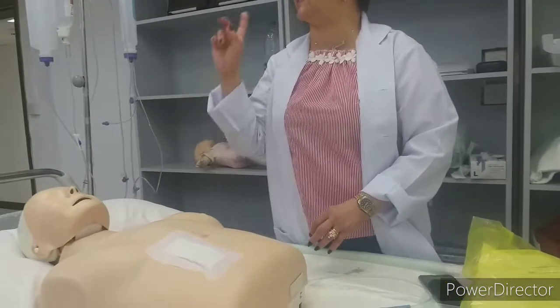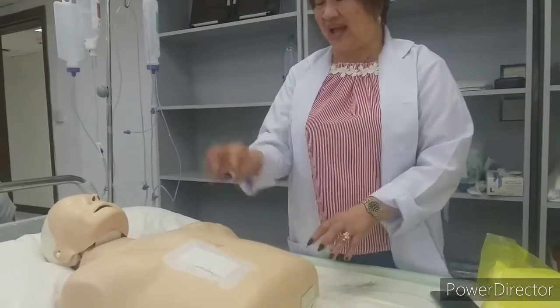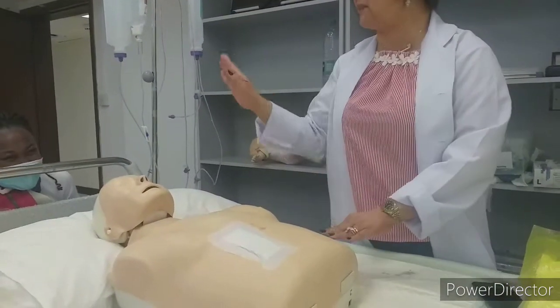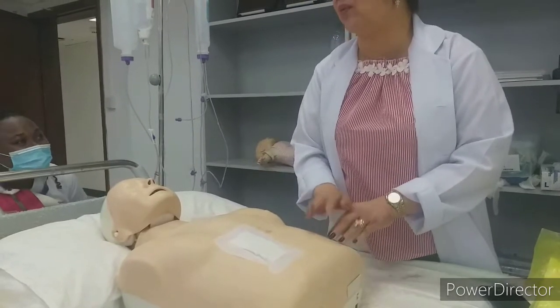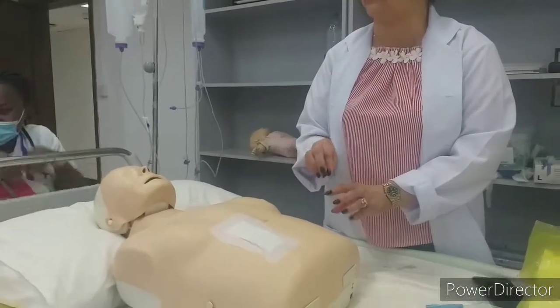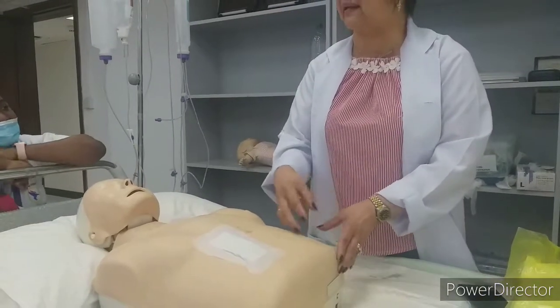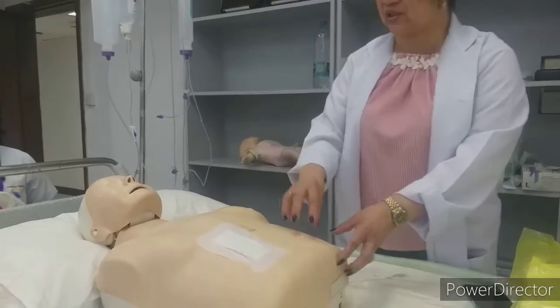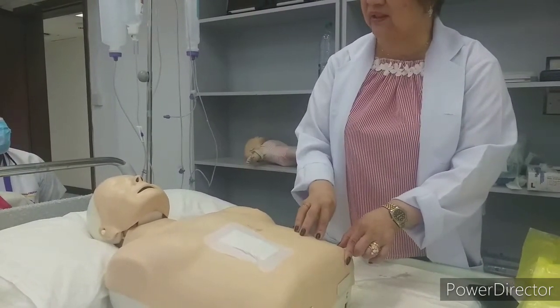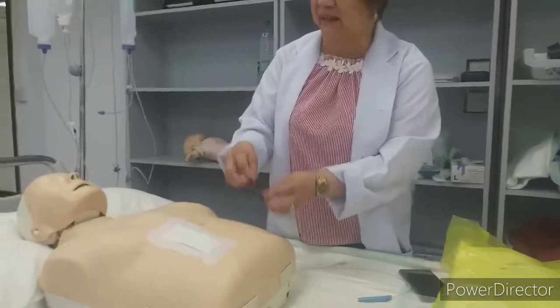I cannot imagine how you will be when you see exactly what I'm talking about. So, you do not be afraid if that is a piece. Sometimes this one is going in. When that goes in, you pull it out a little bit. Because once it goes deeper, it needs another surgery. The hole is enough for that colon to go out. So once it has been a long time and it is going in, put it a little bit out.